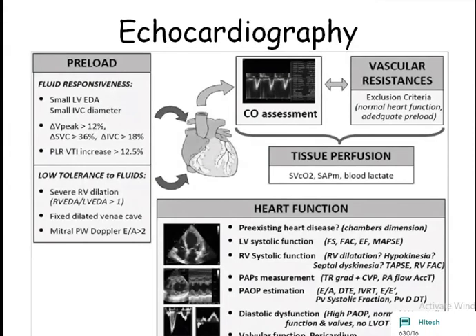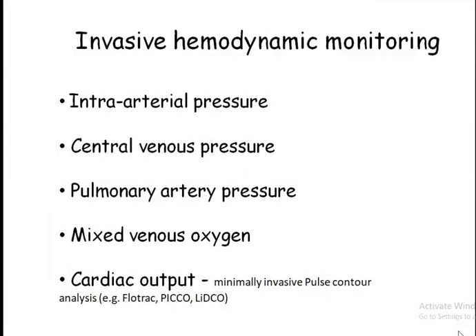You can also do a passive leg raising test and then assess how much the cardiac function or the cardiac output has increased. So these are simple methods, and with echocardiography you can easily assess whether you have to give more fluid or not. Now these are the important things which we will be discussing about hemodynamic monitoring.